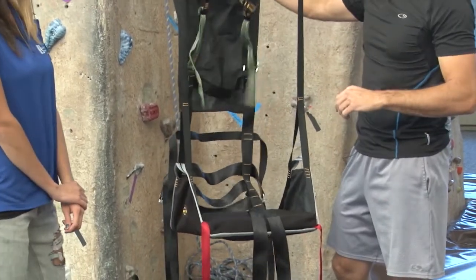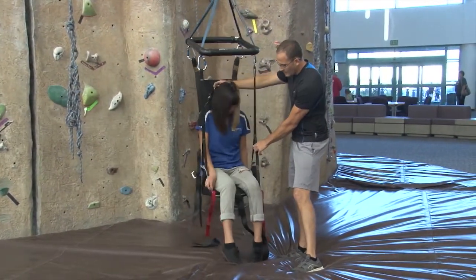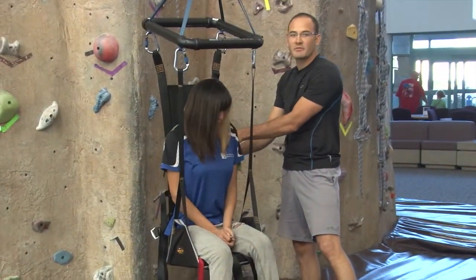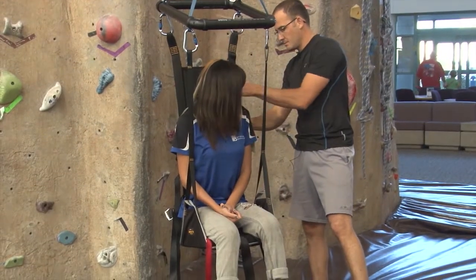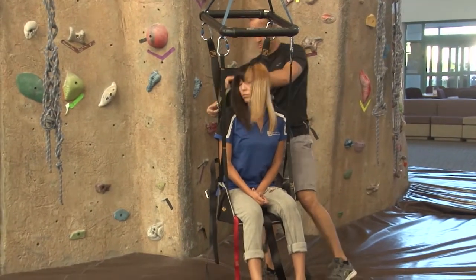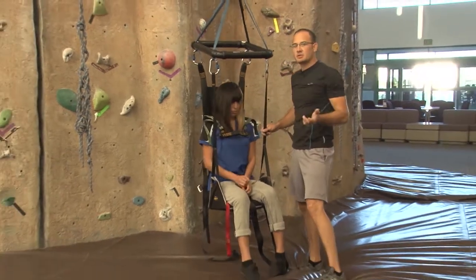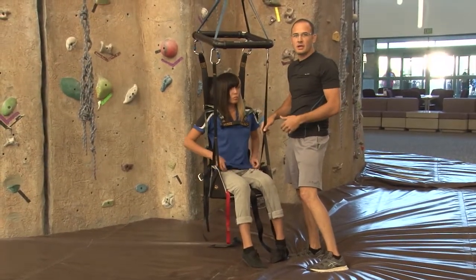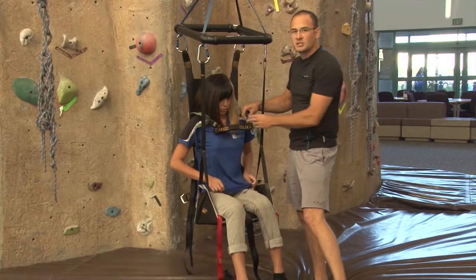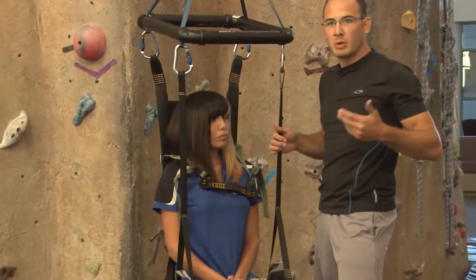We're going to have Evie step in or sit into the chair. We're going to adjust the shoulder straps so we can put the chest strap over the top of her head. For some individuals, we may have to lift and put them in the chair and do some type of chair lift transfer. For our chest strap, we'd really like it to go just around sternum height, below the nipple line.